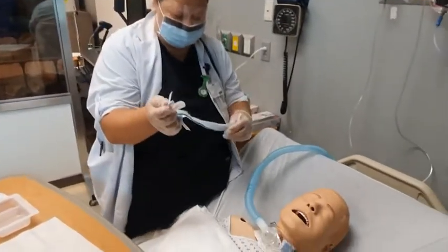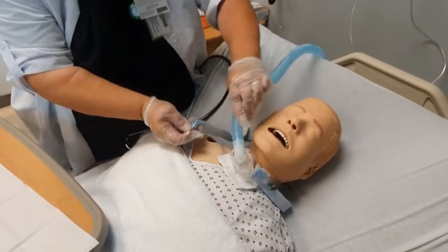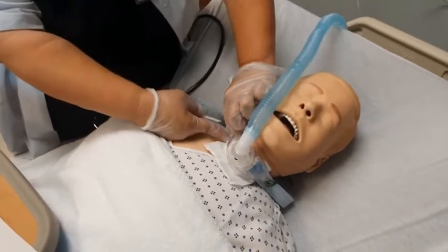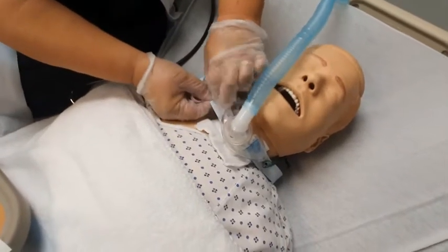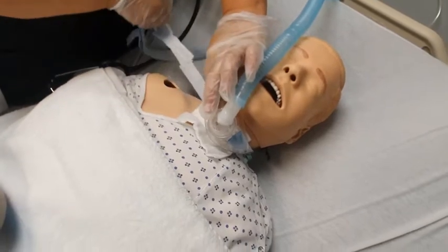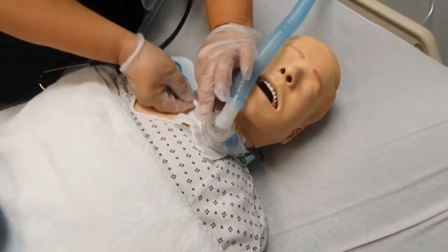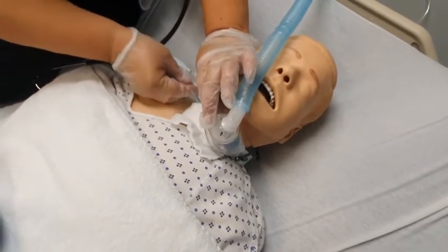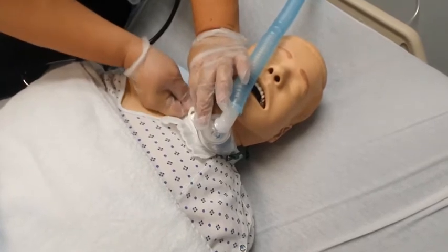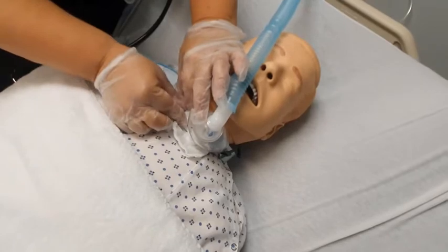So on this side of the neck, you see the little flange that's right here. You will take this side off. Because these get really nasty, right? They have the secretions and stuff. So you want to make sure that you can get these cleaned up. And you'll thread it through.